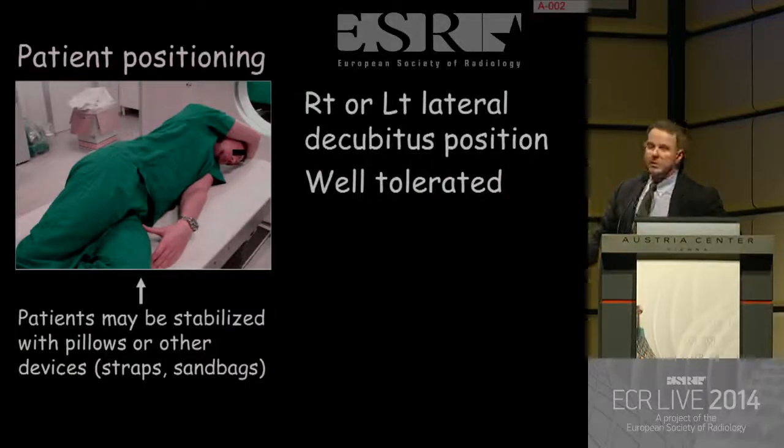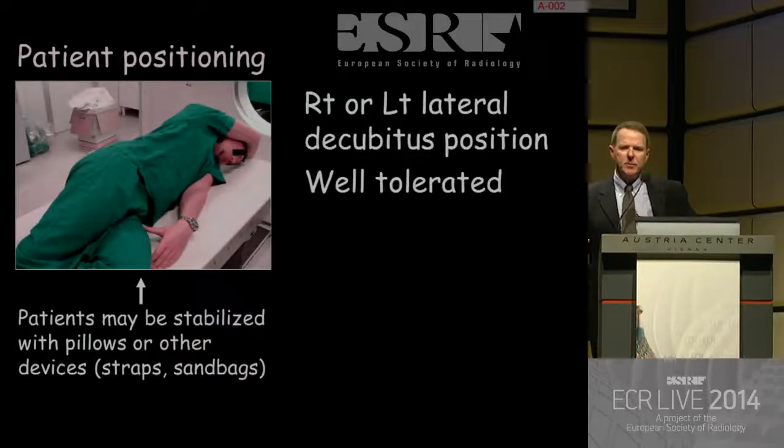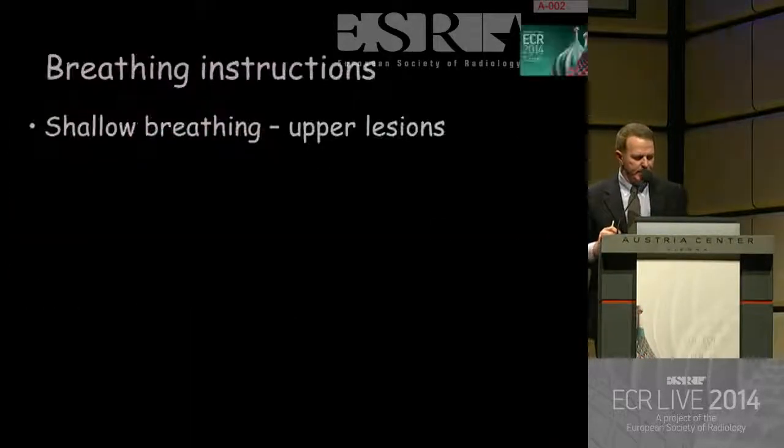Sometimes you will have to use the lateral position, and you can stabilize the patient with pillows, sandbags, straps, the straps that you have seen before to hold the arms. Whatever you do, do everything you do to improve the patient compliance with the procedure. The patient, sorry to say, should be dead and stable. Okay? If he moves or she moves, you're in trouble.